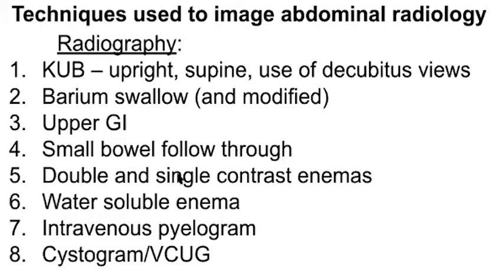For a barium enema, a rectal catheter is inserted into the rectum and contrast is slowly injected. This is routinely done in pediatric population. Here we have the contrast injection and the patient is rotated laterally to look at the evaluation of the sigmoid, and then the contrast is injected until the entirety of the colon is evaluated. Here we see that the contrast enters and goes into the ascending colon. This is a dynamic process, so you're evaluating the contrast as it fills the length of the colon. That's the single contrast enema.